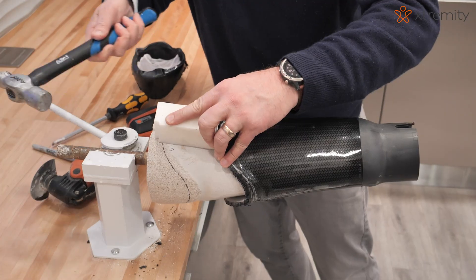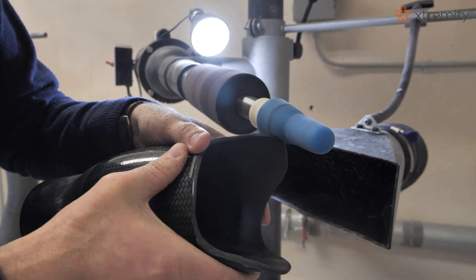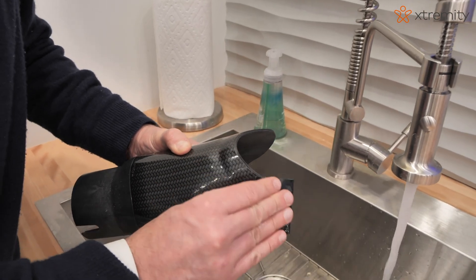Trim, remove the socket, and smooth and buff the proximal brim of the socket. Ensure the outer surface of the brim is smooth to preserve suspension sleeve life.